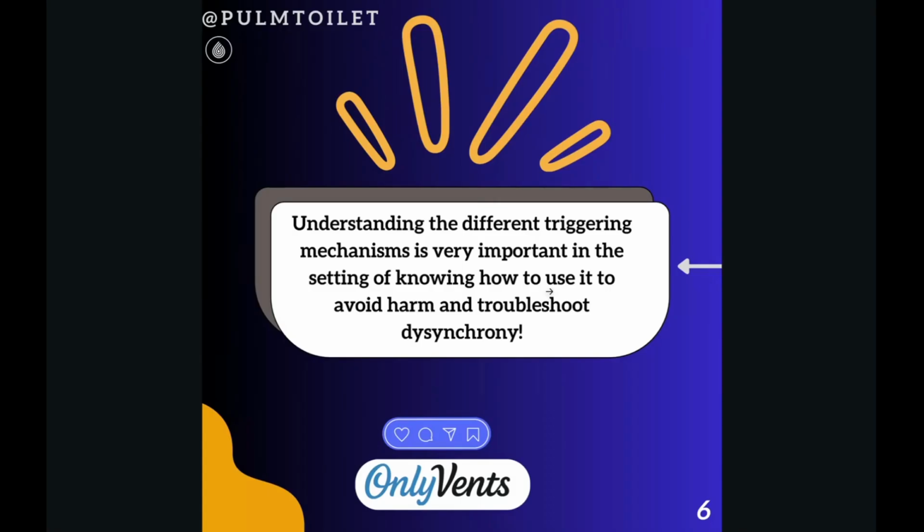So it's important to know the triggering mechanisms and their associated dyssynchronies, as this can cause a lot of pain and suffering in the ICU, especially if you have something like auto triggering or delayed triggering. Certainly ineffective triggering is something very important that we should be able to identify, because it's a cardinal sign of auto peep, especially in people who might not have the ability to do an expiratory hold and measure the auto peep. I'm thinking more of the pre-hospital folks on the T1s that can't do the holds, and they have to infer from the waveform if the patient has auto peep.